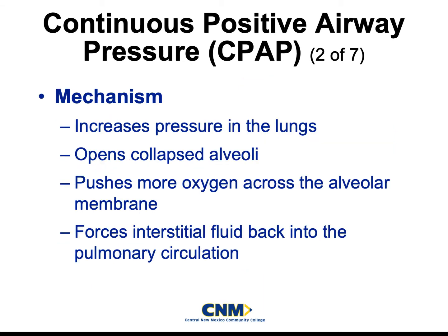So with CPAP, what this is actually doing is increasing that pressure gradient into our lungs. So it's actually forcing that diffusion of oxygen and carbon dioxide. It will open up collapsed alveoli. Think of this as like a security fence that prevents the alveoli from collapsing on themselves. It stents the airway open all the way down to the alveoli level. We can actually push oxygen into the alveoli level, even if they do have fluid in their lungs, right?